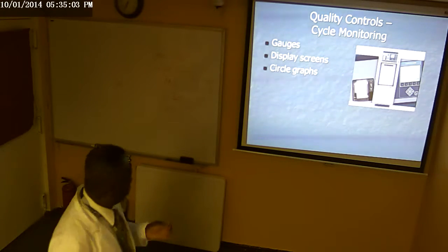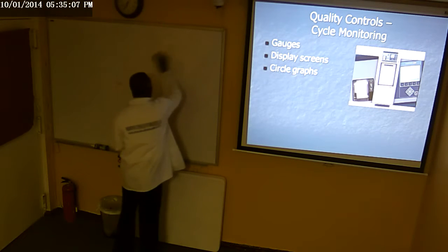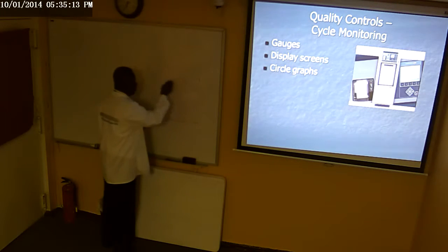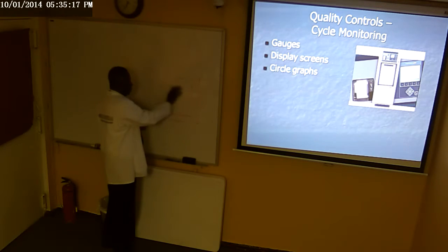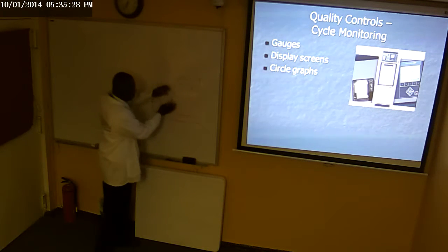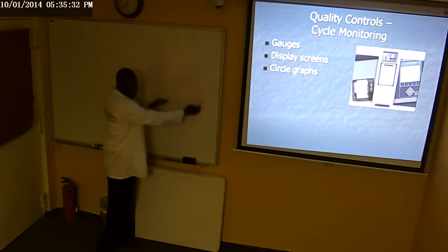The sterilizer is designed this way, and then another one like this. It's designed like a chamber within a chamber. And this is the door. So this chamber is inside another chamber, but there's an opening around it. The opening around it is what we call the jacket.